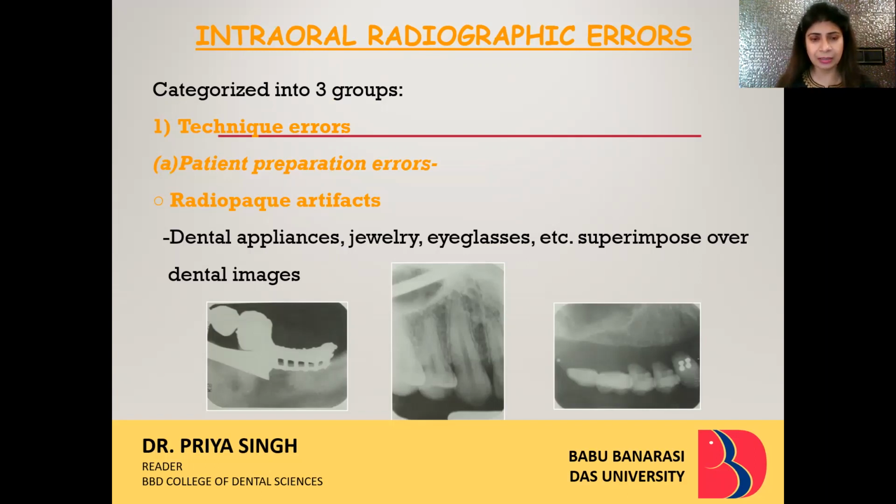And the third being the manhandling. At times, even if the technique as well as processing are done very nicely, but the preservation has not been done nicely, again this can lead to artifact. So first of all, the classification of artifacts into these three broader categories and identification of each will help in not making these errors in future.